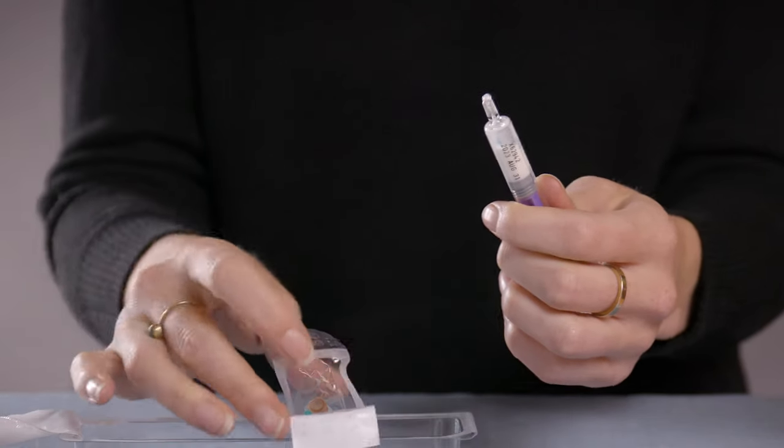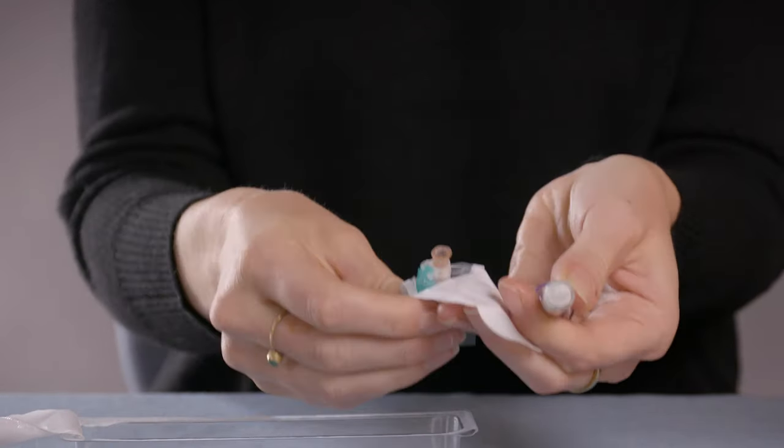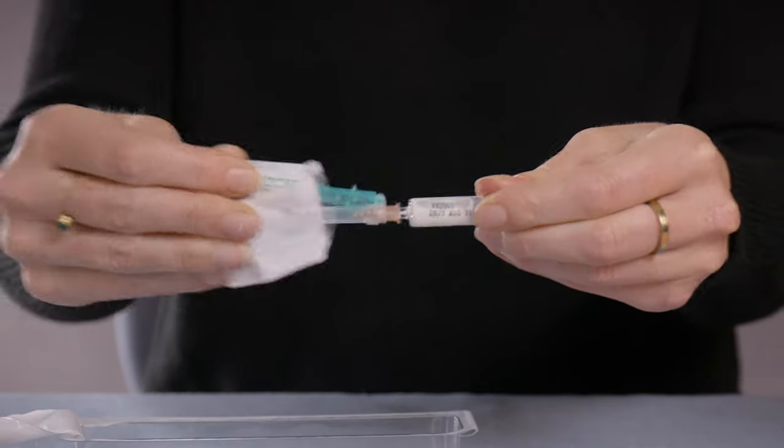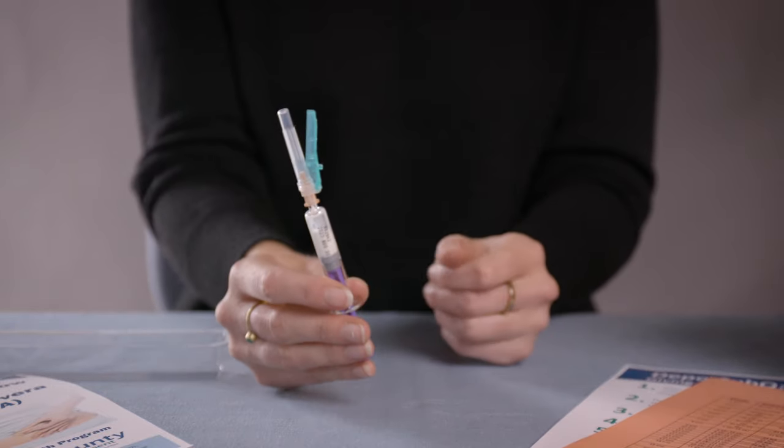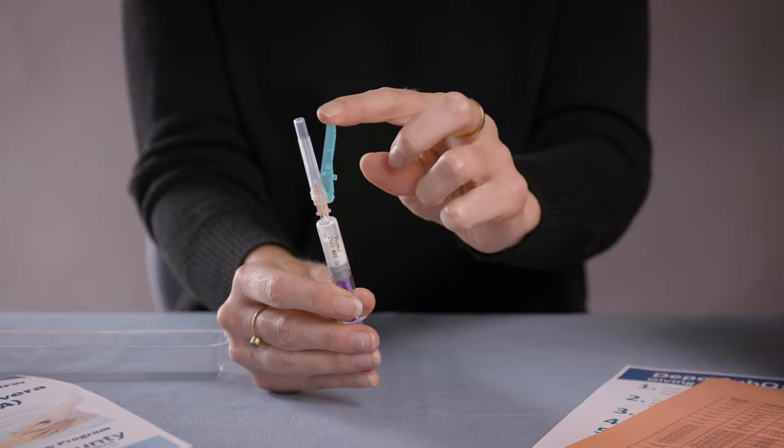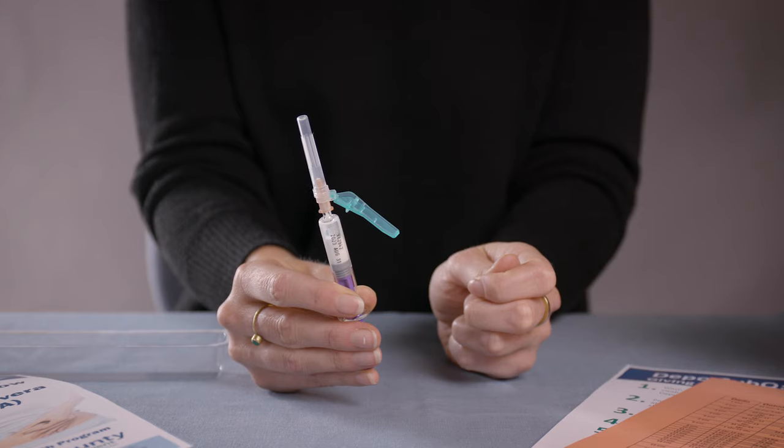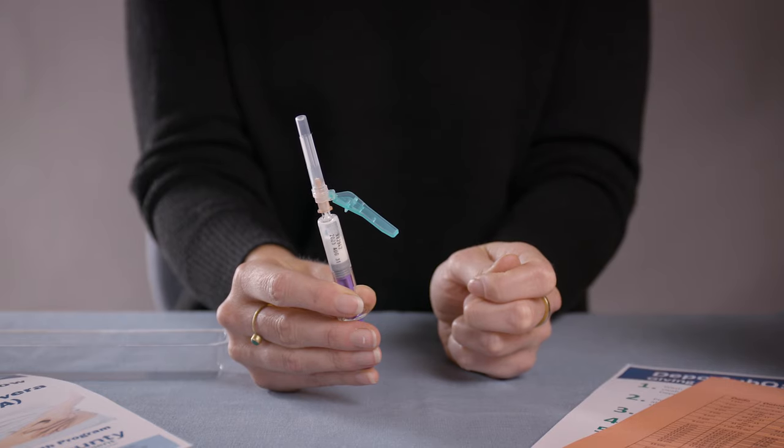Remove the gray rubber cap from the syringe and attach the needle by pushing and twisting it into place. The needle has a safety shield that you will use after you give yourself the injection to cover the needle. For now, place the shield away from the needle so that it will not be in the way when you give yourself your injection.